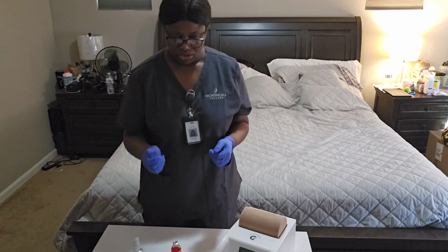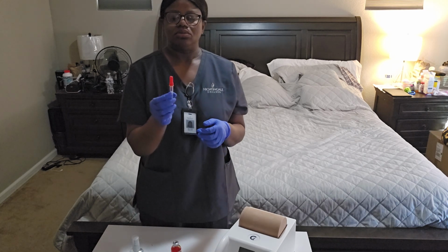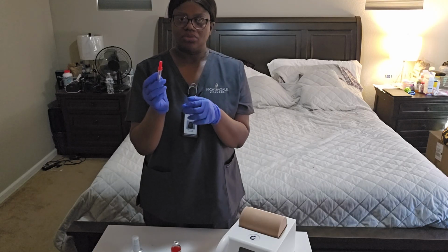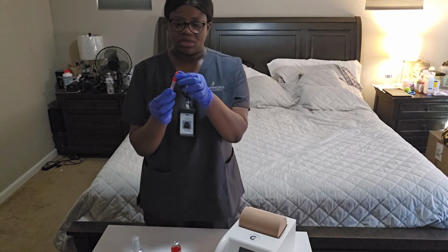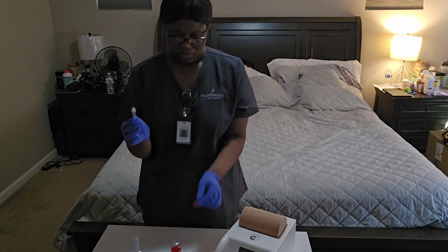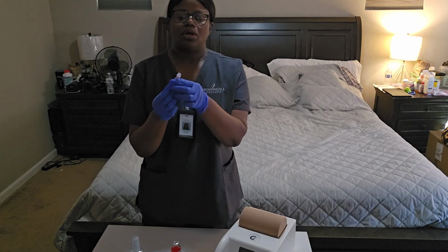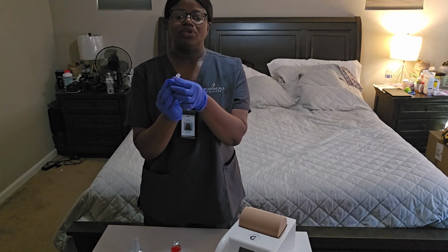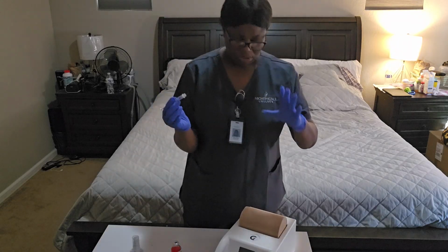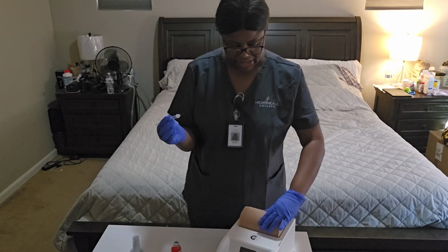Okay, so when it's drying, I am going to take off the top of the needle. I'm going to hold it bevel up, hold it like a dart. With my non-dominant hand, I'm going to taut the skin.